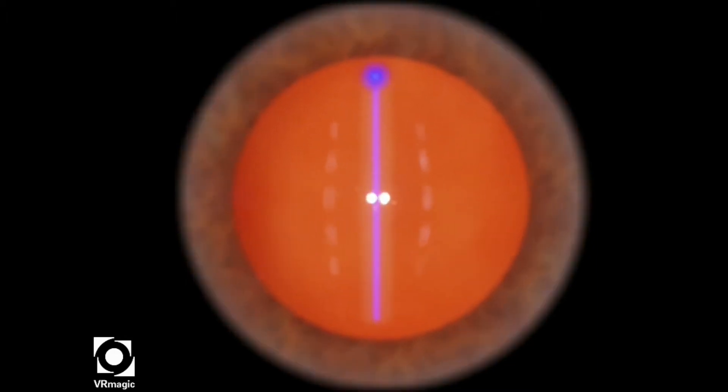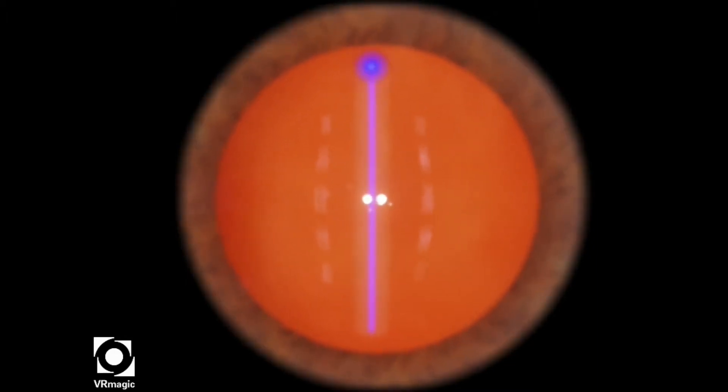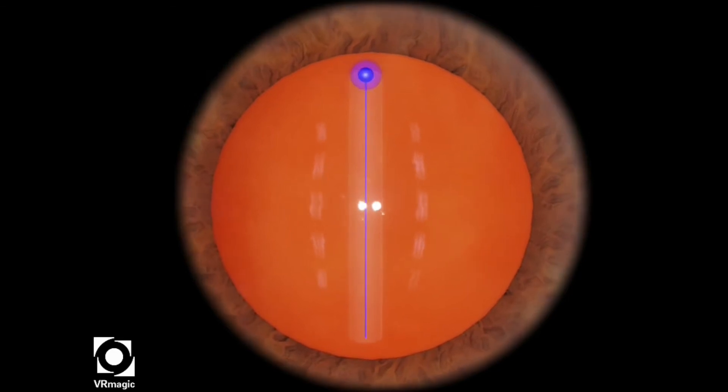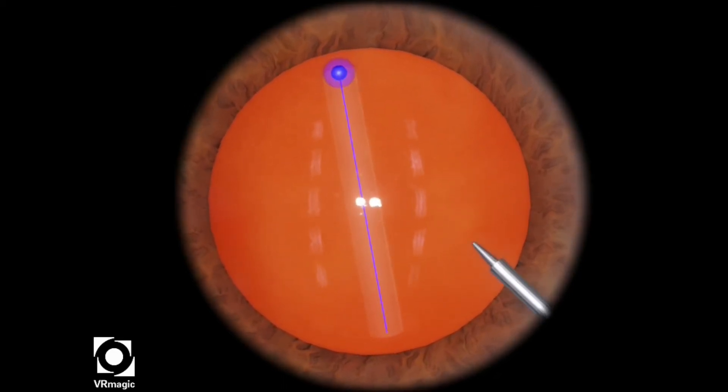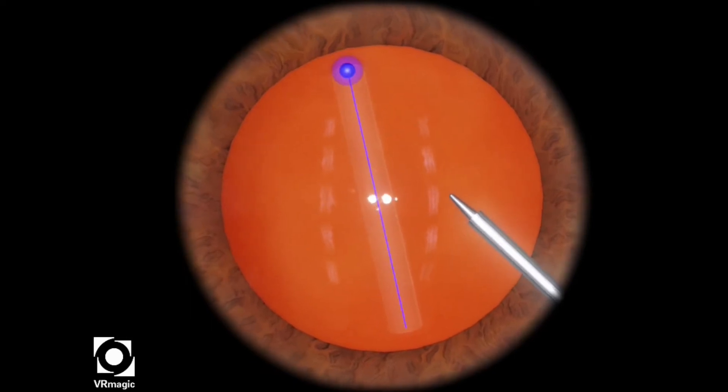This task is the first of a series of anti-tremor training tasks, and today we will be exploring a simple straight line tracing.